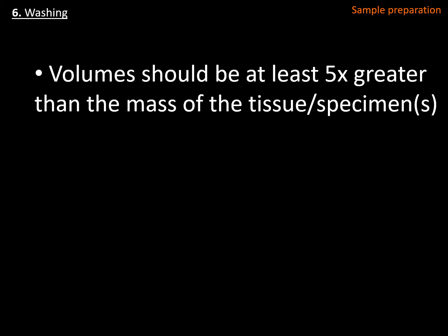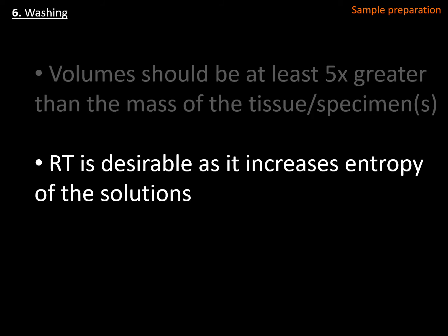This would allow for a greater dilution of the antibodies that are non-specifically bound and will enhance your capacity to release those non-specifically bound antibodies from your specimen or tissue. Room temperature is normally desirable because it increases the entropy of the solutions and increases the stringency of your washing conditions.